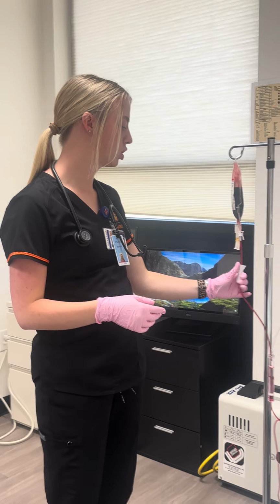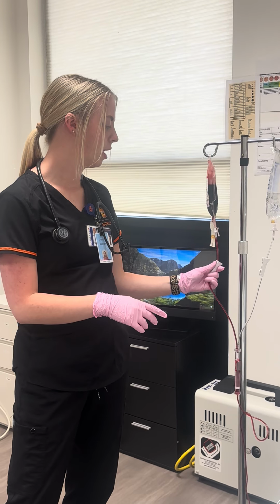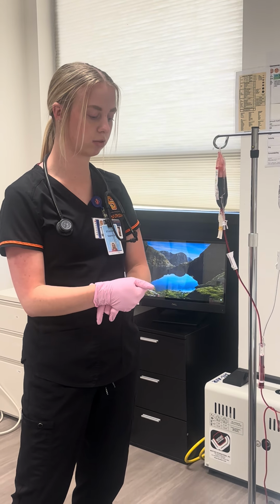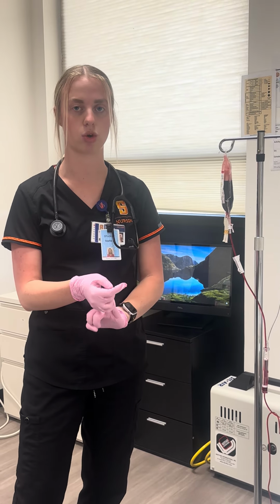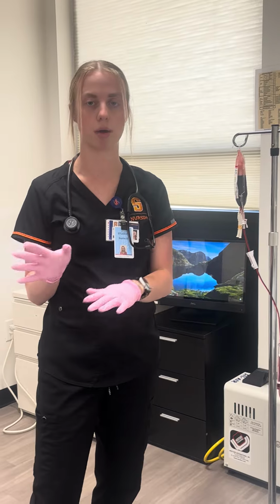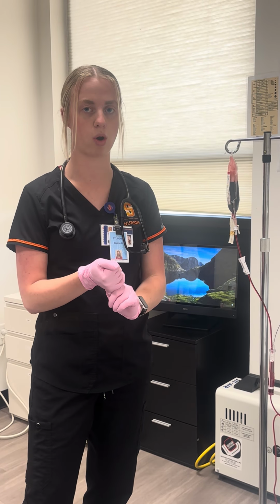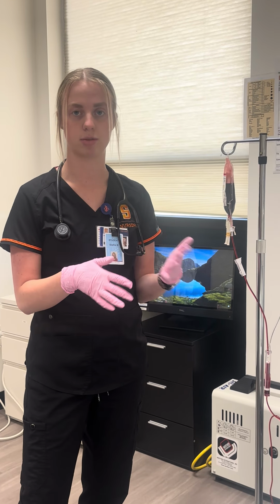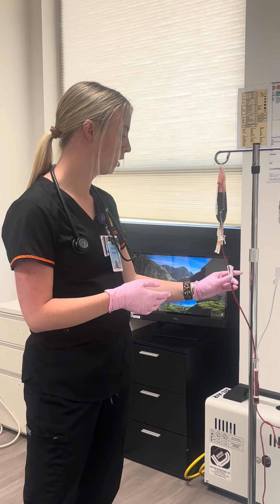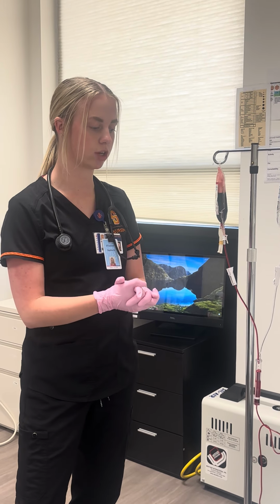I would also probably stop at that point and ask my patient if they're experiencing any reactions. If my patient was experiencing any adverse reactions, we would stop the transfusion, hook up all new lines, and run a normal saline through all of it. I would take the bag and put it in a red biohazard bag along with all the tubing and send it back to the blood bank for that to be checked, and I would notify my provider immediately along with reassess my patient.